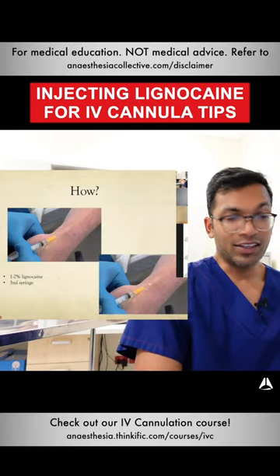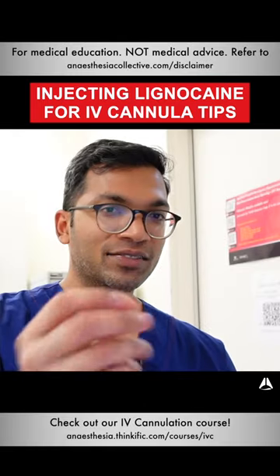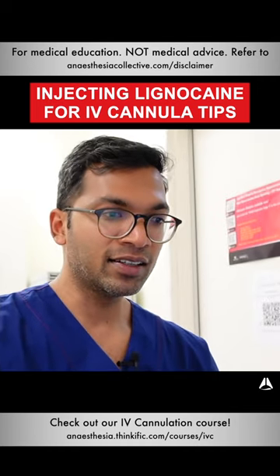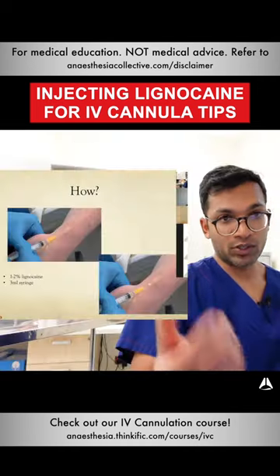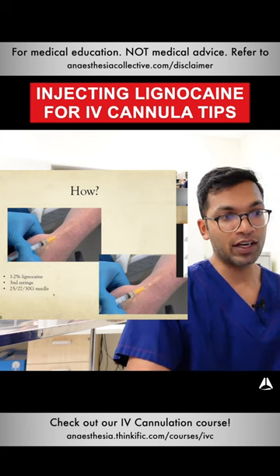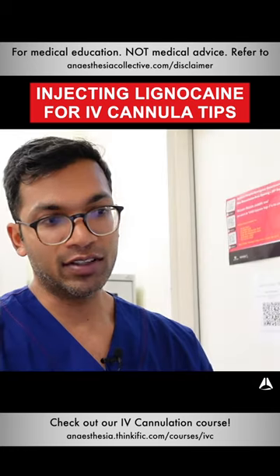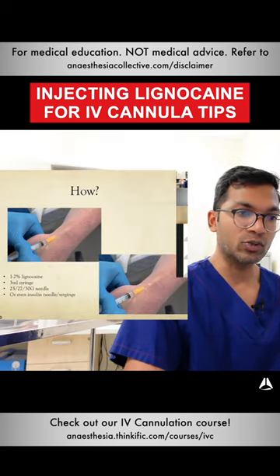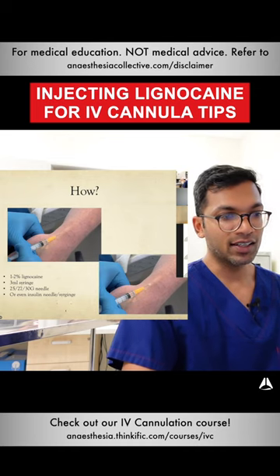One to two percent lidocaine is fine — you don't need a high strength, it's such a small nerve fiber that requires very little concentration to anesthetize. Use a 3ml syringe or small syringe. 25, 27, or 30 gauge needles are all fine, but the smaller the better — if I've got a 30 gauge I'll definitely use that. Pre-made insulin needles, which are 27 gauge, are fantastic.